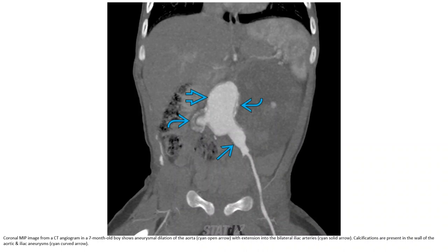MIP image from CT in a seven-month-old boy shows aneurysmal dilatation of the aorta with extension into the bilateral iliac arteries and calcification in the wall of the aorta.